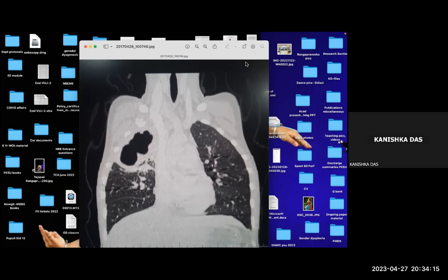Tuberculosis. Yes. So common things you should not forget. Tuberculosis. After all this, then you can entertain other possibilities. We have not given you other pictures. So maybe you said that it could be a duplication cyst, etc.